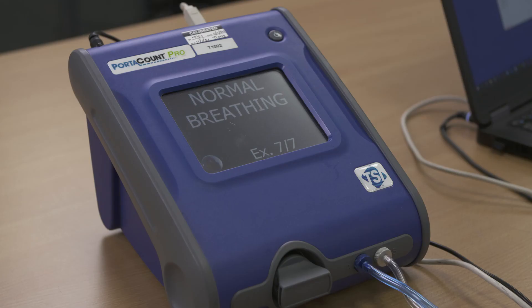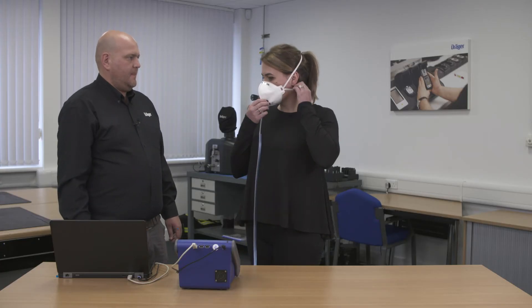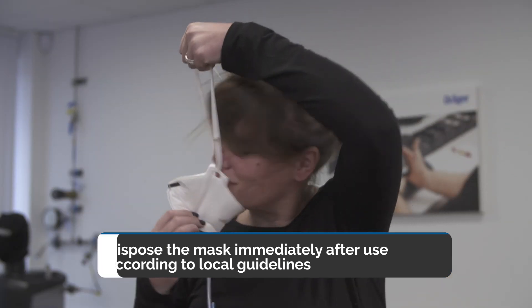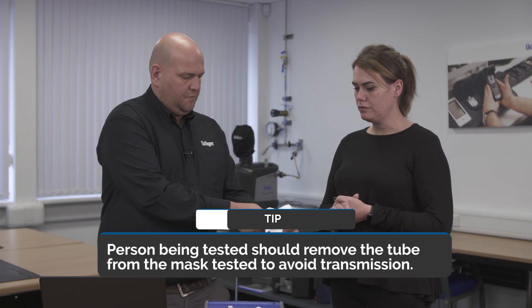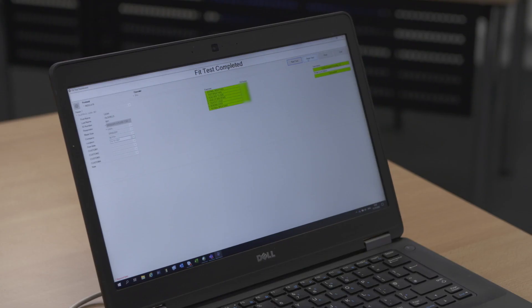On the beep of the machine, go back to slowly stepping backwards and forwards with normal breathing. That's excellent — the test is complete. If you want to remove the mask from your face. Can I ask you to dispose of that mask please? The test shows a pass with a fit factor of 172 for the Explore 1730. Once the results have been saved you can then bring in your next testee.